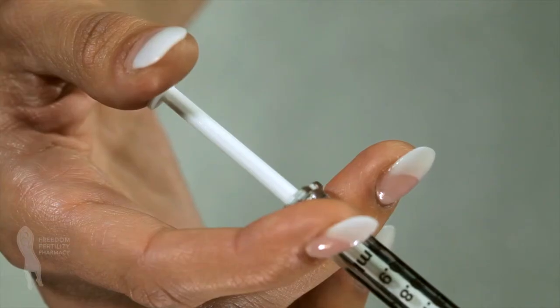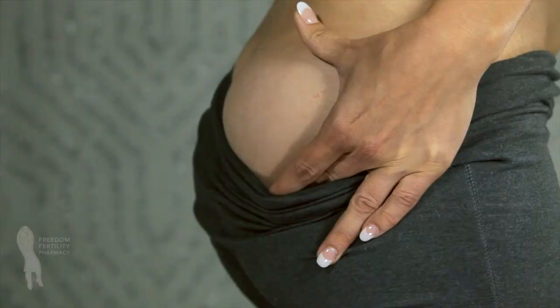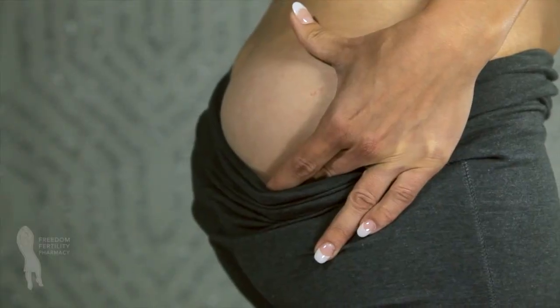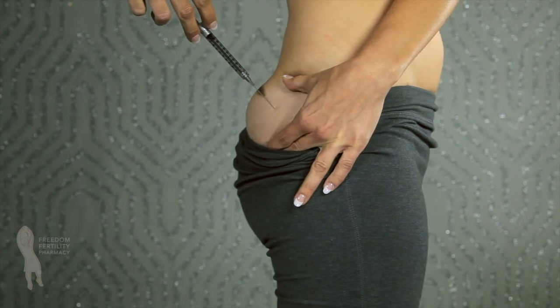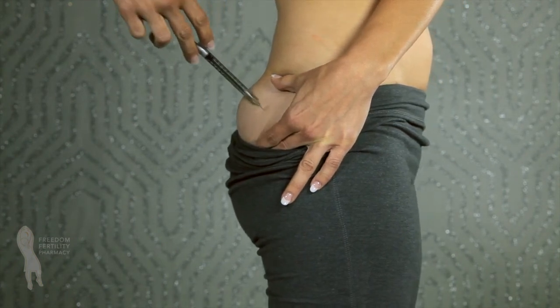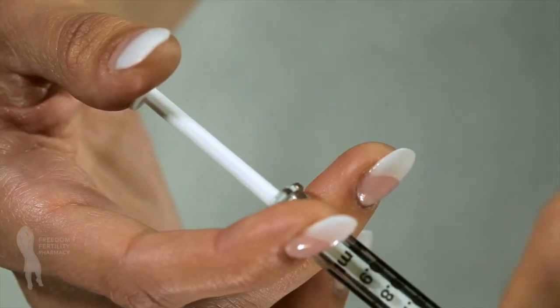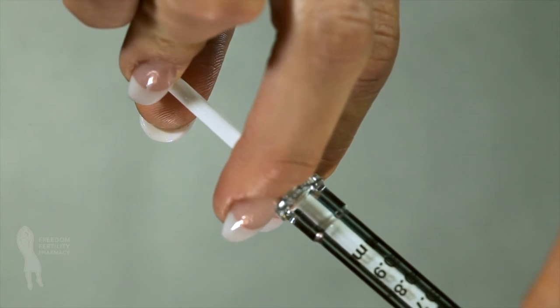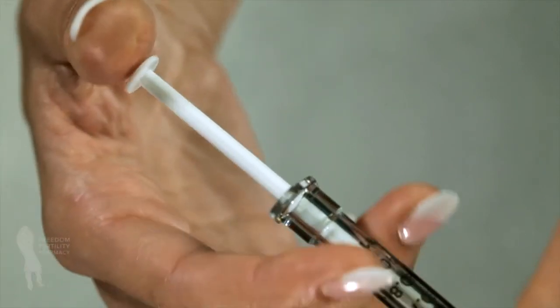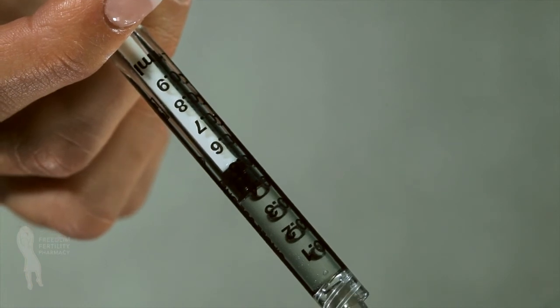Hold the syringe in your dominant hand like a pen or pencil. Use the thumb and index finger of your other hand to gently spread the skin at the injection site. Insert the entire length of the needle in a quick dart-like motion at a 90-degree angle straight in. Hold the barrel of the syringe in your non-dominant hand and very gently pull back on the plunger just a bit to check for blood. Do not pull forcefully back on the plunger.